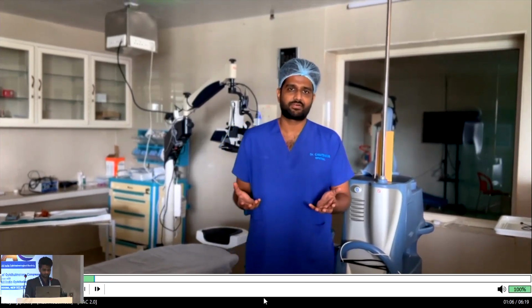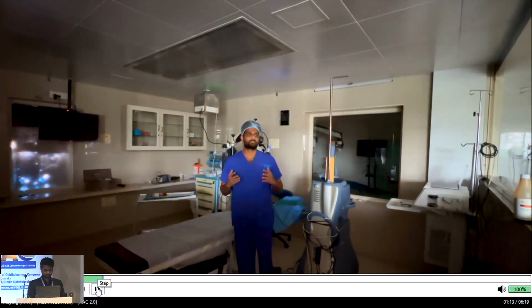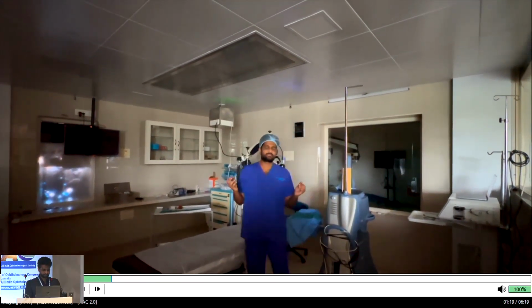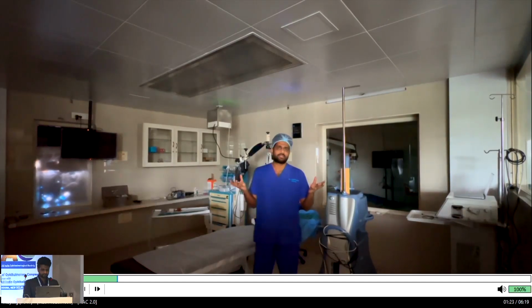So I have programmed my entire OT with voice commands, as it will be much easier for surgeons to operate with voice commands. So let me show you how the first voice command is designed into the OT. So let us see how everything comes to life with this one simple command.